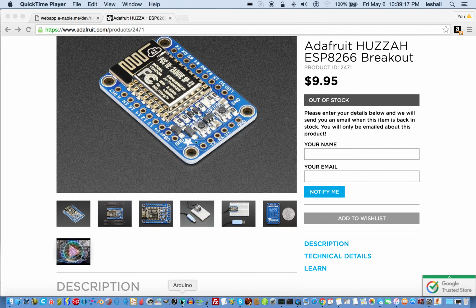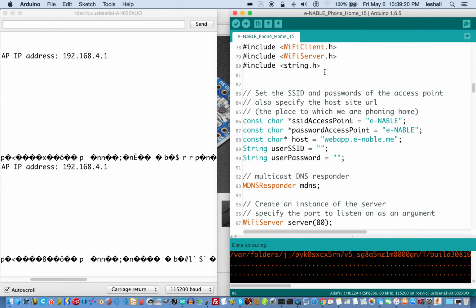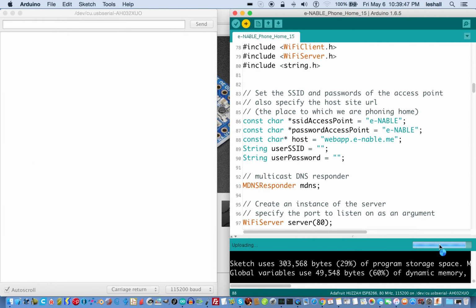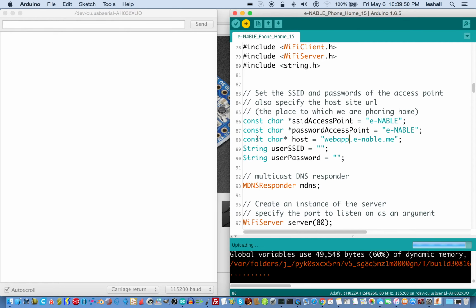So we will call up our Arduino software. To the right is the software, and to the left we have the wonderful serial monitor. Now let us upload. We got to compile it. It'll compile it automatically, but anyway, it compiles clean. And let us press the upload button. So it's showing us a progress bar, and it's programming with a blinking display of lights that you can't see because they're on the boards, and they go for a while.